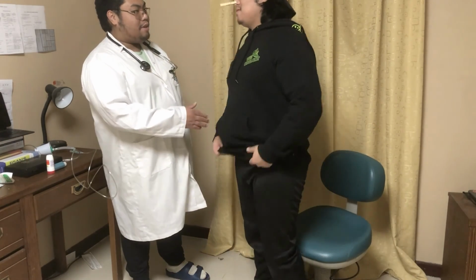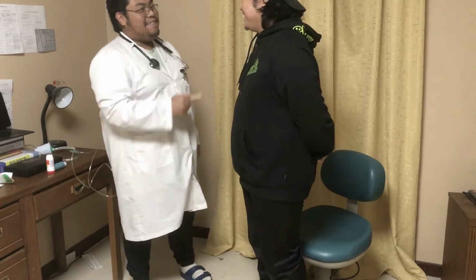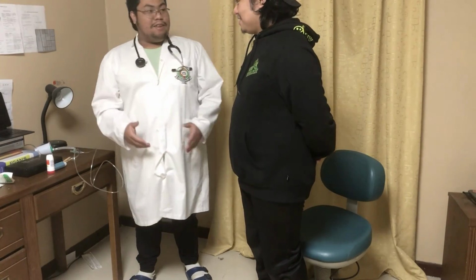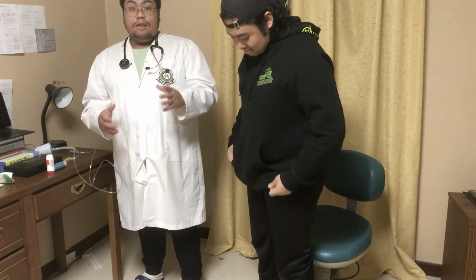After doing all the tests, congratulate your patient and thank them for their cooperation. That will give them more confidence to come for more test results. So, sir, can you stand up? Thank you for the test today. You've been very cooperative, and I'm glad that all our tests are complete. So after that, you're going to print the results and make the patient read it, and then make them go to his consultation.